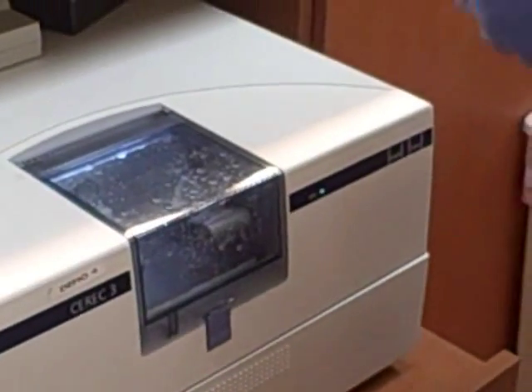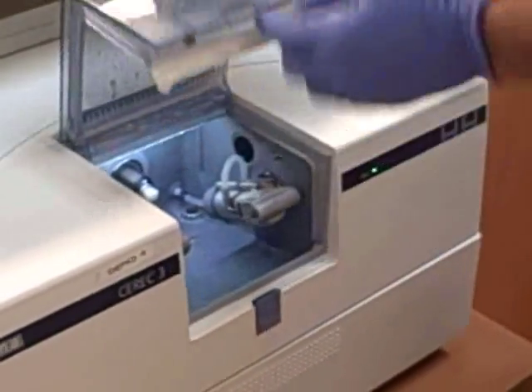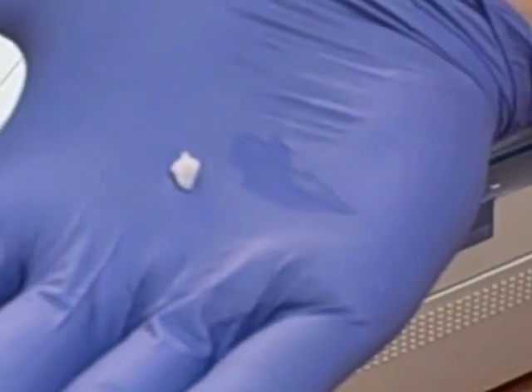Here we are five minutes later, halfway through the milling process. And here we are 12 minutes later — our enlay. The puzzle piece has been completed. As tiny as the restoration is, it is separate from the block. This then fits within microns of what's existing inside the mouth and will fit in her tooth.